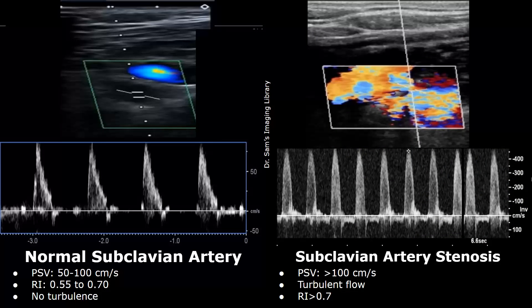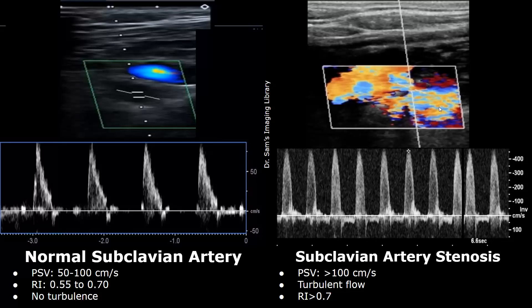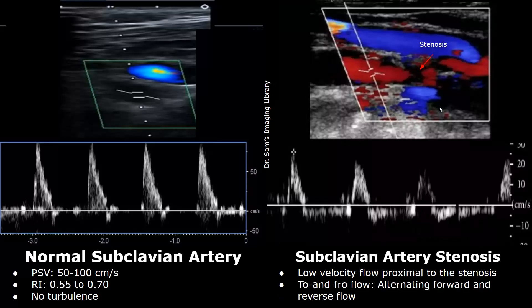Here we have a case of severe subclavian artery stenosis. The PSV is more than 400 centimeters per second. You can also notice turbulent flow in the artery. Turbulent flow is seen as mixing of colors on color Doppler. Proximal to the stenosis, that is just before the stenosis, you may find low velocity flow and to and fro flow as well.